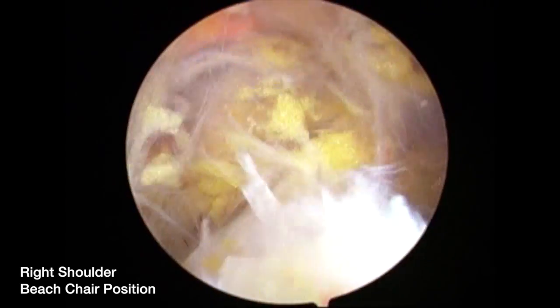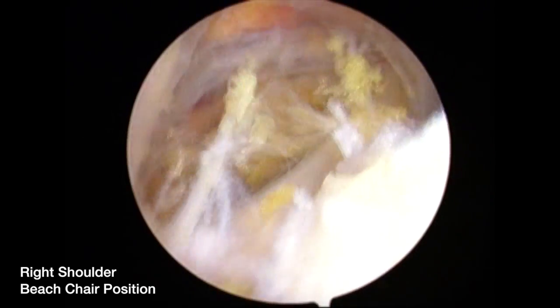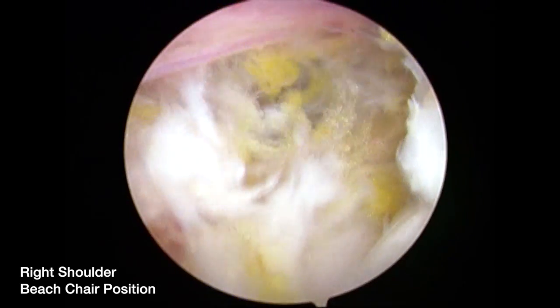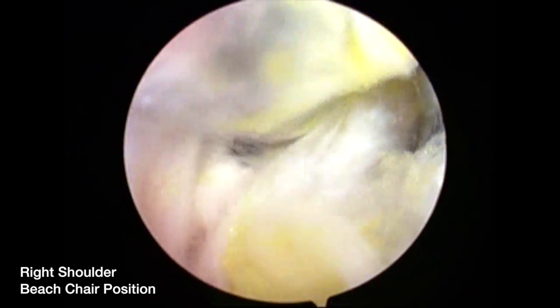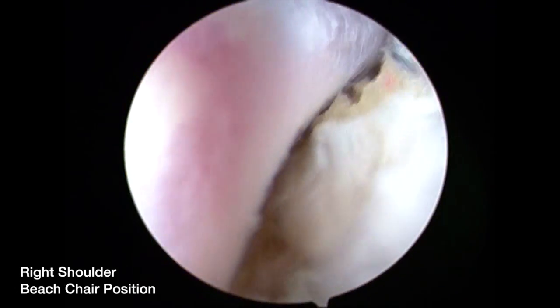We have not found it necessary to perform a neuroplasty. Further dissection with the trocar in the suprascapular nerve portal confirms that the nerve has not been injured.